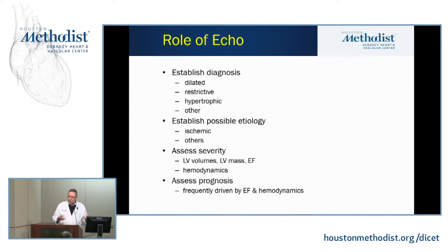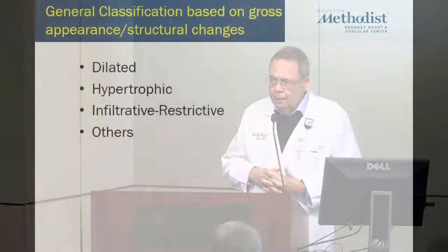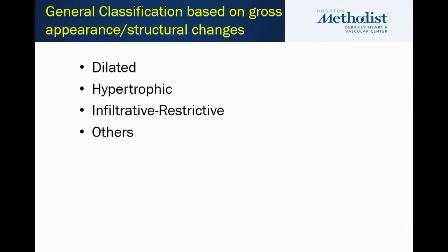For instance, diastology, very well shown. If you have an EF of 35%, but your diastolic parameters all show normal left atrial pressures and PA pressures, you have a much better outcome than if you have a restrictive filling pattern with very high wedge. So clearly, there are a lot of findings that will help the clinician risk stratify the patient. And that's why echocardiography has been the main starting point for these diseases.